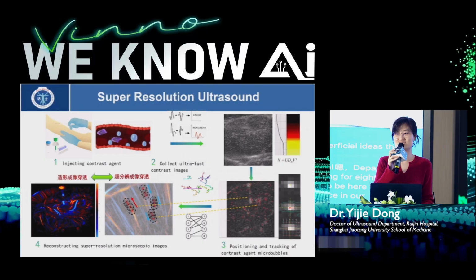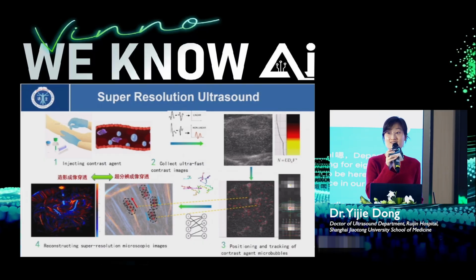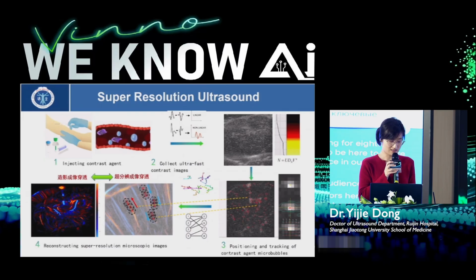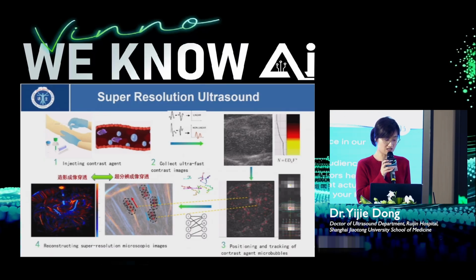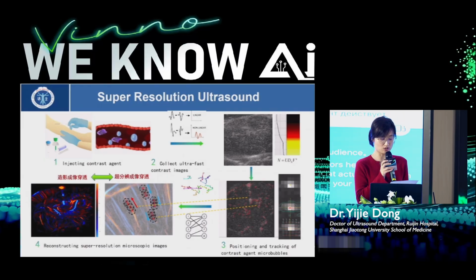then I'd like to introduce these innovative technologies to you. These technologies have some key steps. First, we have to inject contrast agents, which is the foundation of the entire process, because the contrast agents act like little guides exploring inside the vessels.